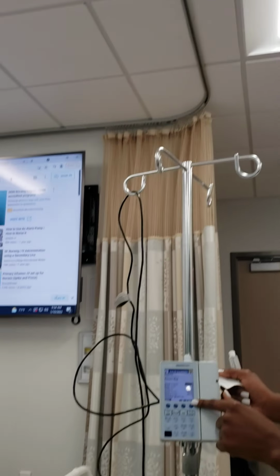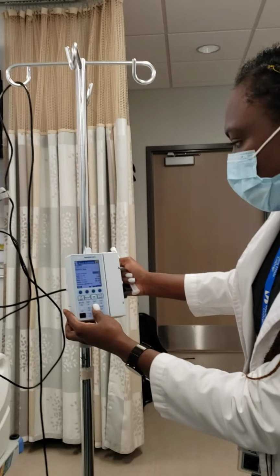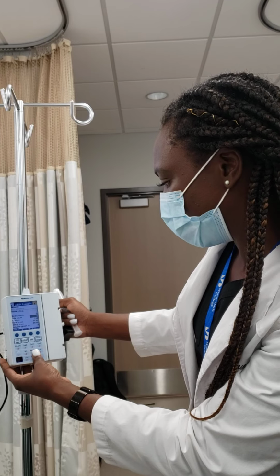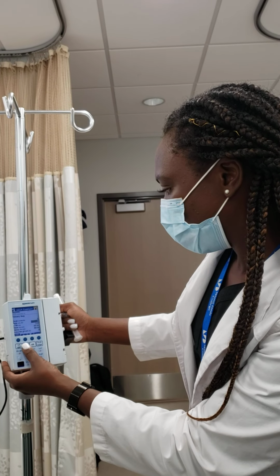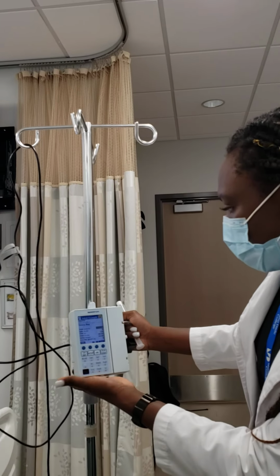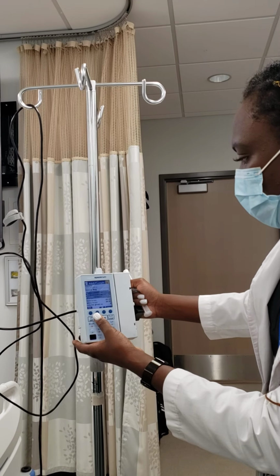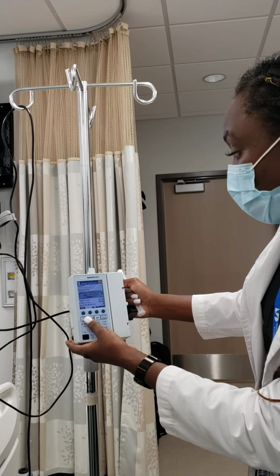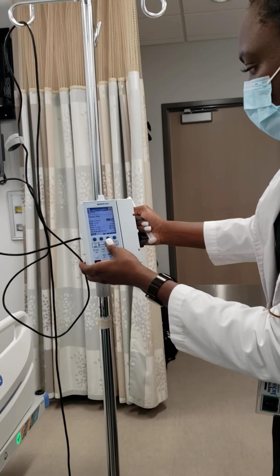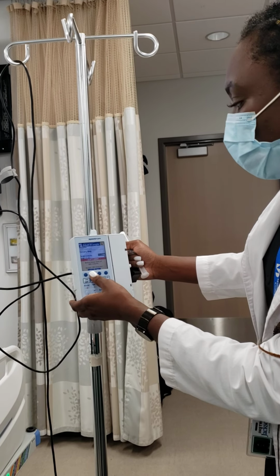MAR. Okay. Once you put in all your information, I'll just do something. For example, I'll just put any number. Rate. I'm not going to do 10 mLs. Actually, let me go back up. Dose units. Dose one. Below lower hard limit, enter a value of 100 or higher. Okay, so we'll do that. 100. Okay, below limit.